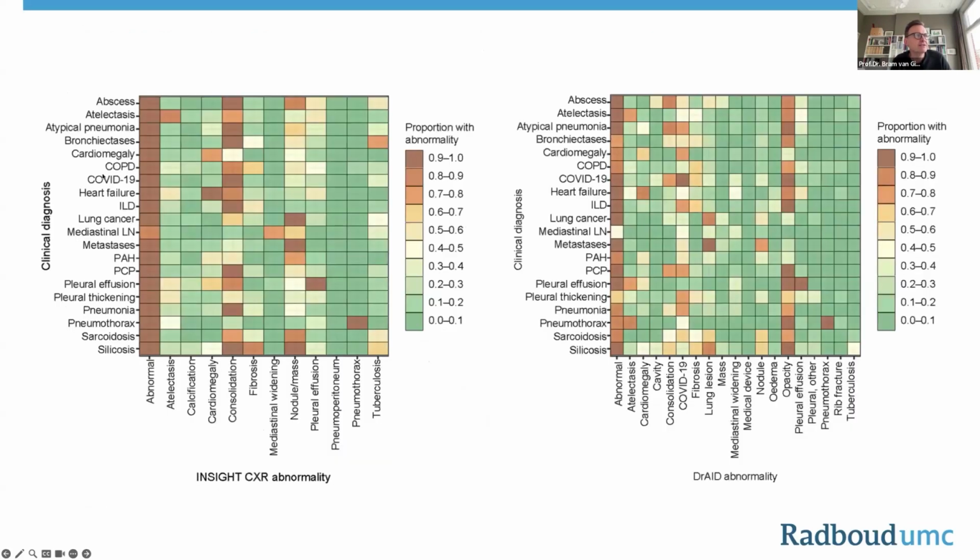Also, if you look at the relation between these findings by the different software and the actual diagnosis, well, in this paper, they also say that atelectasis is a diagnosis. I would not agree with that, but you see that there is a different relationship with it, but it is definitely not that you're immediately making a diagnosis. So I think this is important to realize.